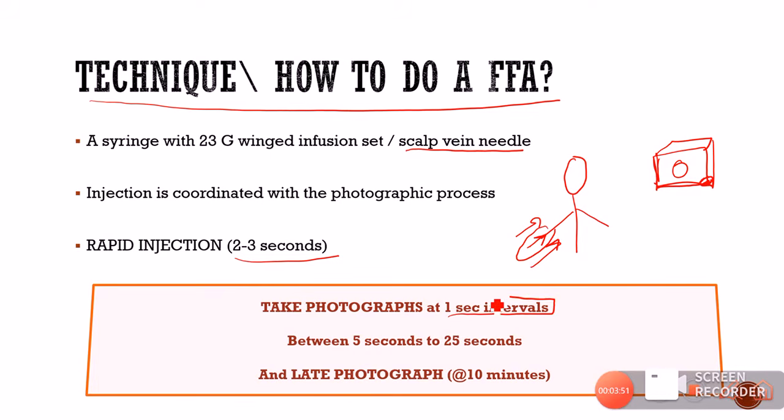You have to start taking photographs from 5 seconds after injection, and keep on taking them every 1 second till 25 seconds. And then later on we take a late photograph at about 10 minutes. This is also a very common question which is asked: how do you take the photographs? At what intervals do you take the photographs in an FFA?